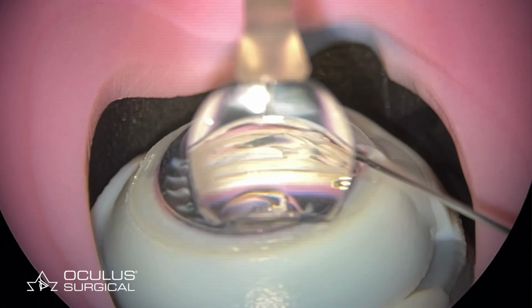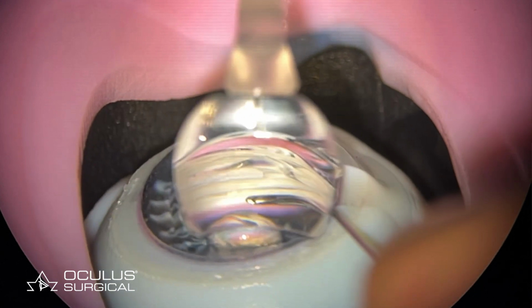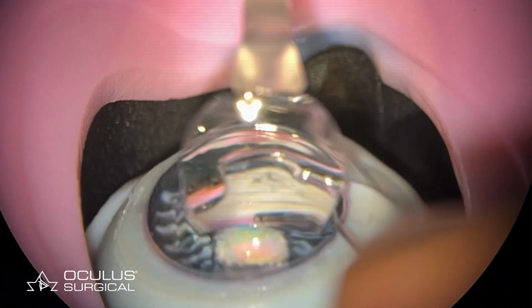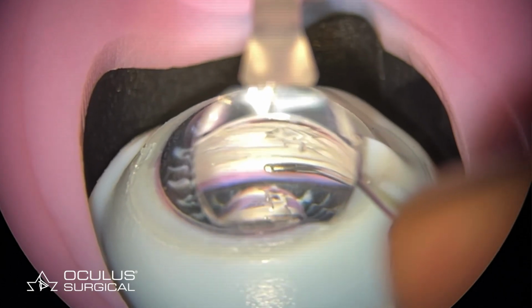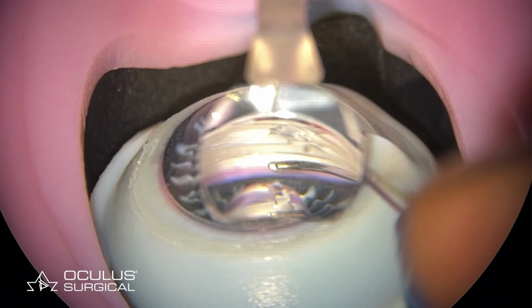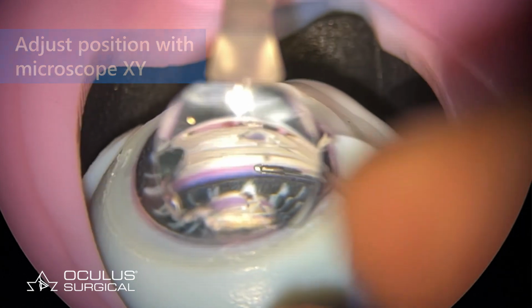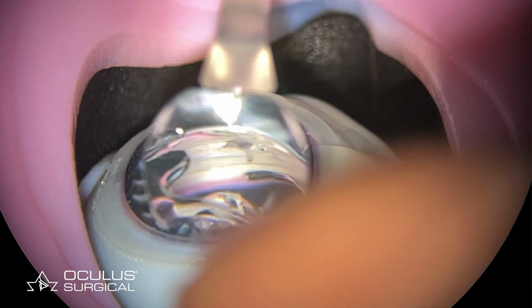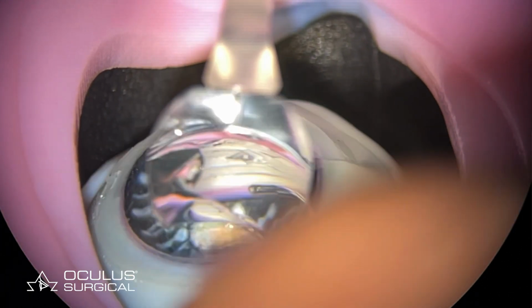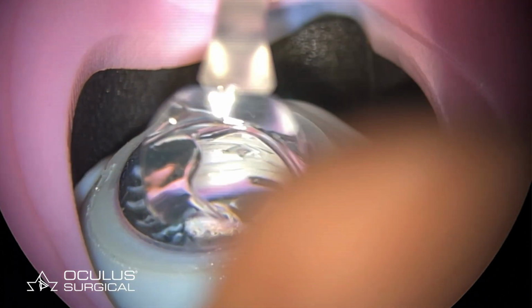We'll come in through that paracentesis wound that we've created. You can see the Hydrus there coming in, again hands-free. You can see for a moment the gonioscopy lens comes off the eye, and all the surgeon needs to do then is use the XY off the foot pedal to come back into proper position. So we'll feed the Hydrus in. You want to kind of bevel in and make a small goniotomy there before proceeding with implantation.